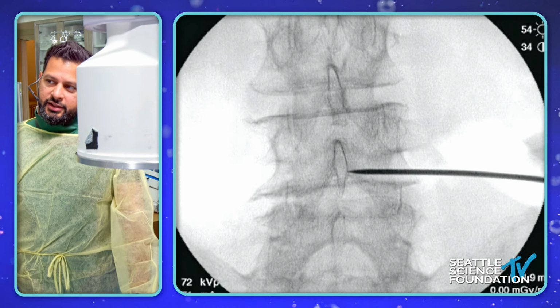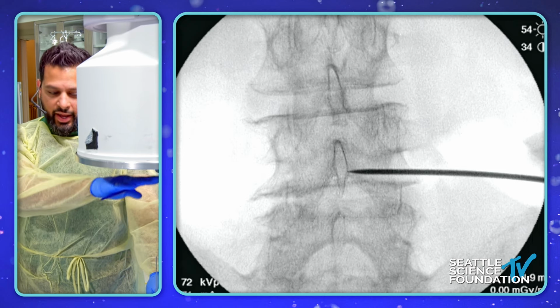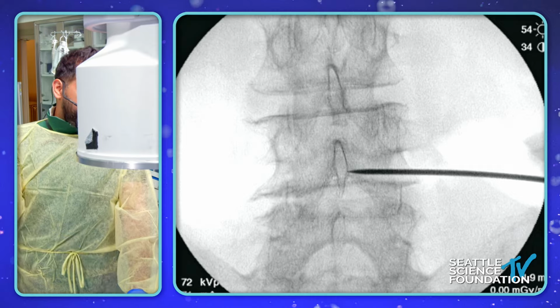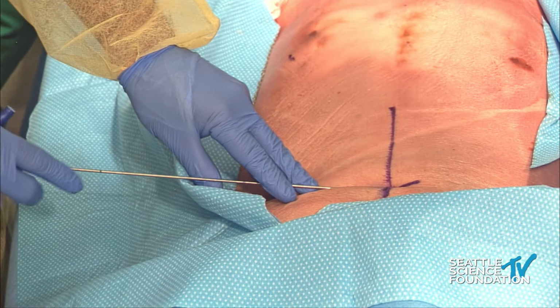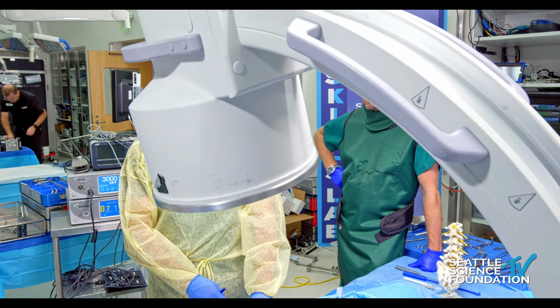If I take this and I just go straight down with my needle, I have to go straight down with the X-ray, and then I'll land on that lamina. But if I go and give me that angle again that way and then come south, so we're gonna, no, the other way? Yep. Shot there. Yep, exactly.